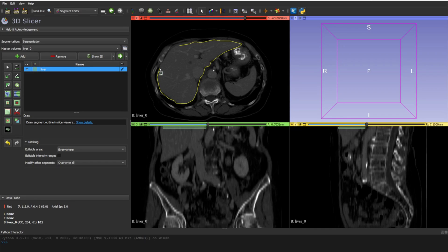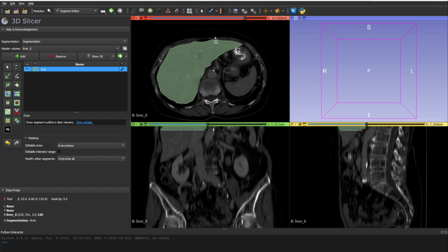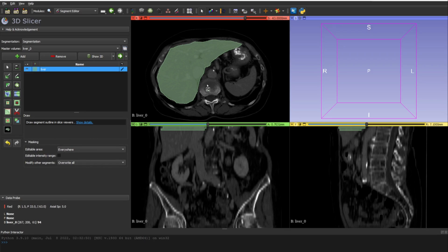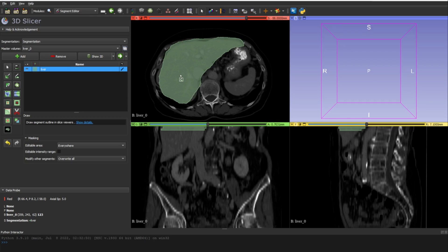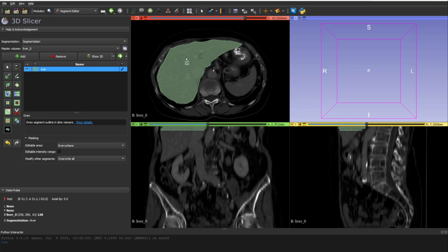I'm pressing the left button to create each point. Once I've traced around the structure, I click the right button to close the polygon and create the mask. So we use the left button to place all the polygon points, and the right button to finalize and trace the mask.